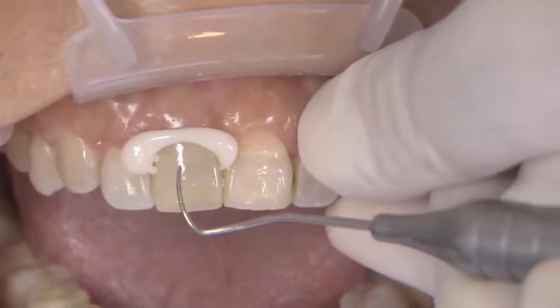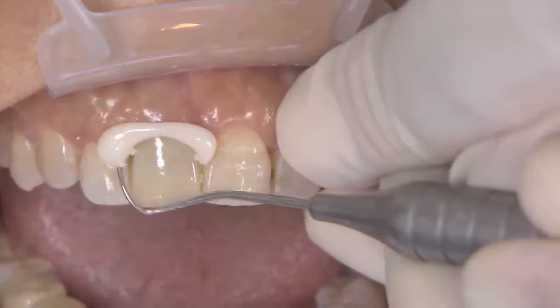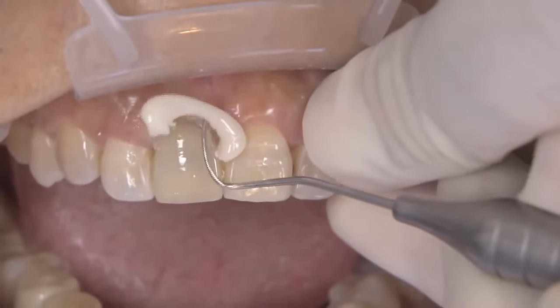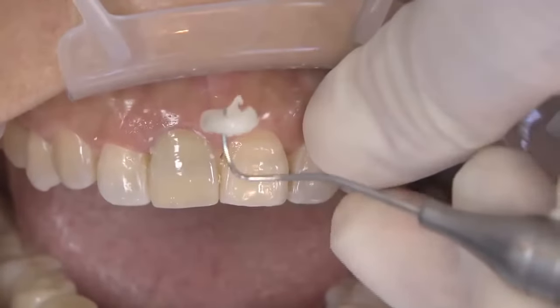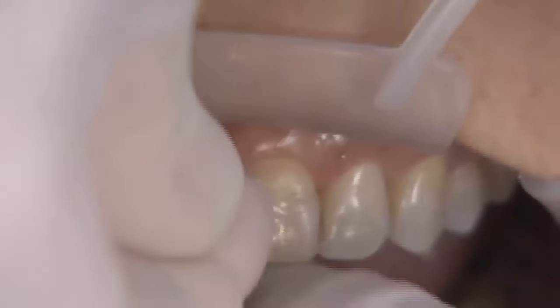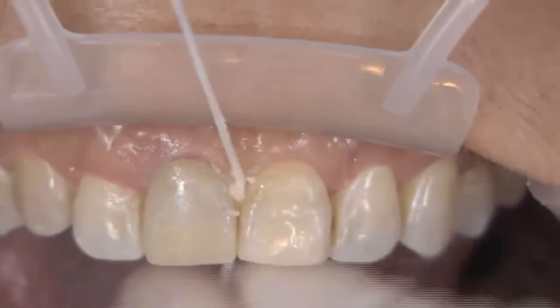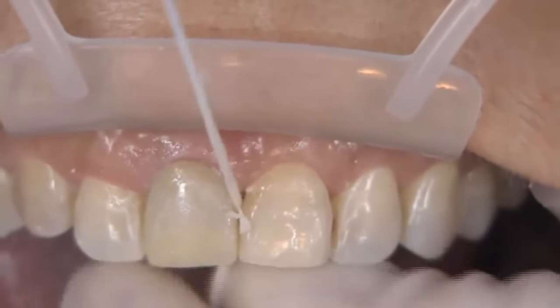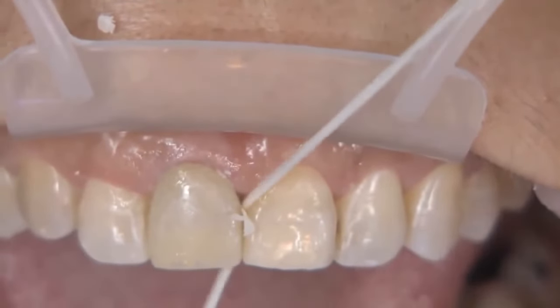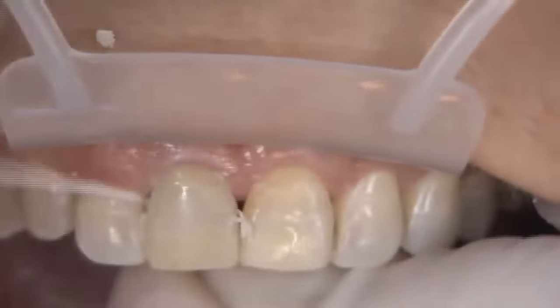You could wait for this without doing any light curing, and it doesn't take a real long period of time. We put the crown in and I cured it for about a second, checked it, and it was still just a little bit soft, then hit it one more time for about another second. With most resin-modified glass ionomer cements, you're putting the crown in and it's going to be two or three minutes before you clean it up — and if you wait a little too long, it's going to be hard as a rock. So it really is nice to be able to cure it, activate it with the light, and start to clean up the margins right away. As you can see, it cleans up very nicely as well.